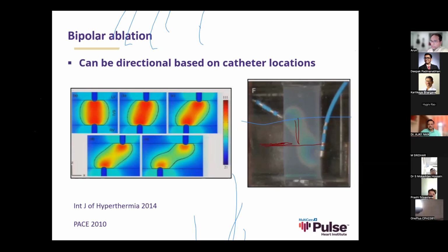Measuring local impedance is very difficult. So that's the reason we watch the live impedance during an ablation lesion. Let's assume we start with an impedance of about 120 and you start an ablation lesion, and then the impedance drops down to 110 or 105, so you have a 15 ohm impedance drop.